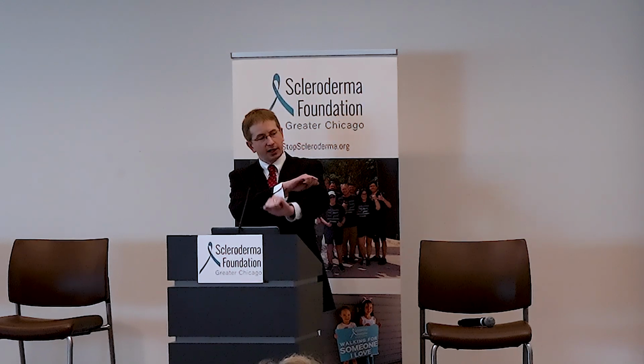It's also a dynamic exam. It's not just a single picture. You can actually actively move a joint or a structure that is impinged or getting hung up on something, and you can watch that on the screen and give that immediate mechanistic insight, so a dynamic evaluation. And then, of course, all of this, ultrasound, great, but what does that have to do with you, a rheumatologist? I can actually do ultrasound at the point of care, right there in the room with you, and that can immediately impact our care plan or guide a procedure.